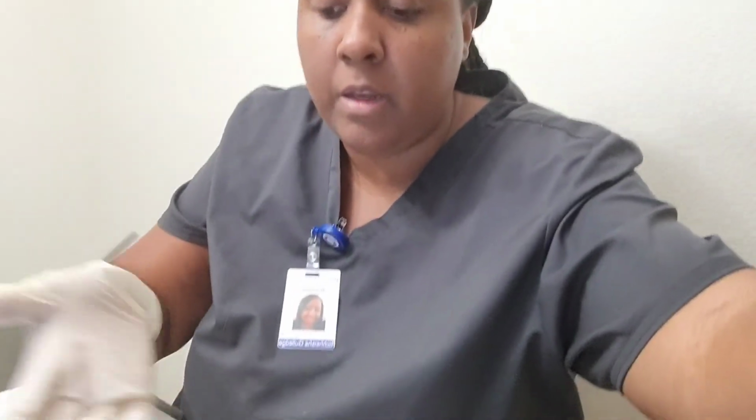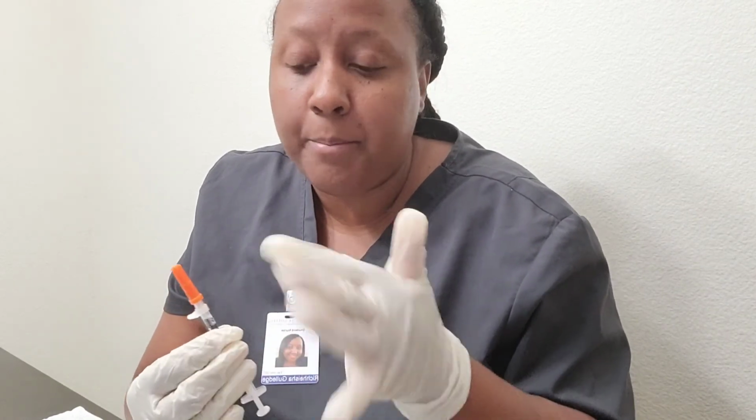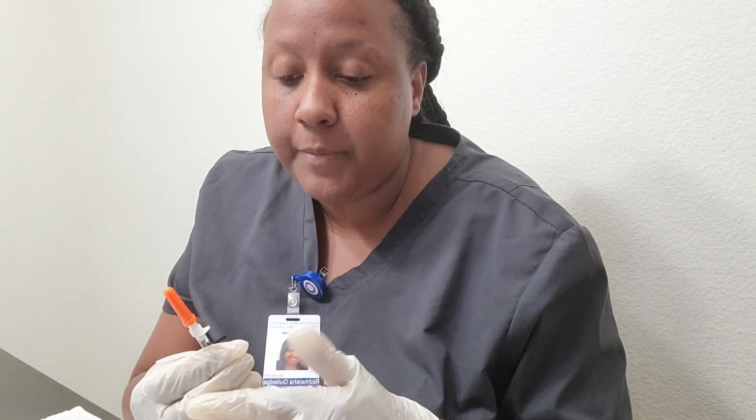Just for safety purposes, I am going to put this back, and it will be laying on a clean area. The thing that I want to note is that when preparing insulin, make sure that you don't overdraw, and also make sure that you don't inject when preparing with more than one insulin.